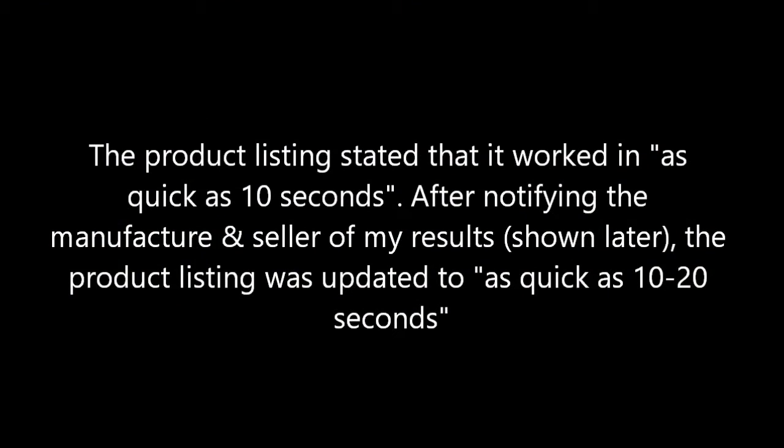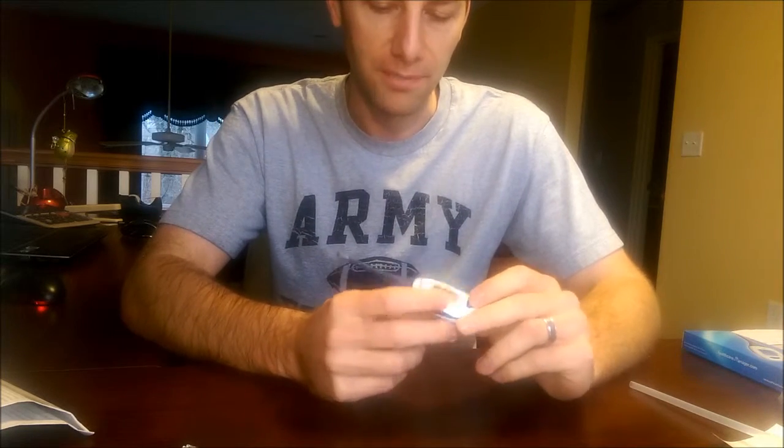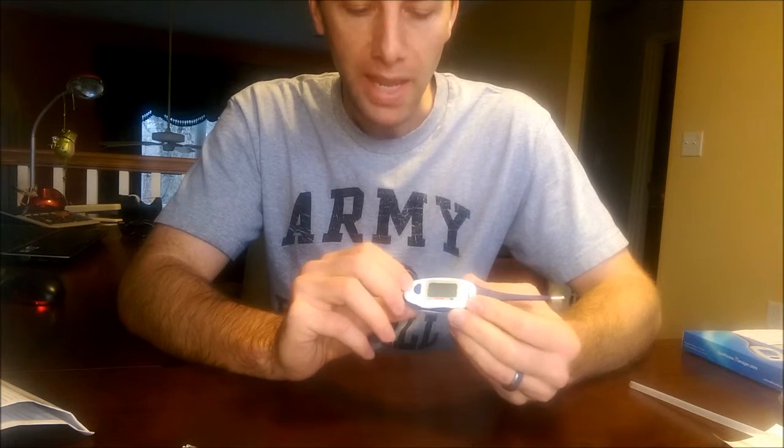I'll show you real quick how fast it works — it says less than 10 seconds. There are three ways to use it: through the mouth, under the armpit, and rectally. I'm only going to show you two; I'm not going to do the third. It turns on, and if you don't turn it off it'll turn off automatically.